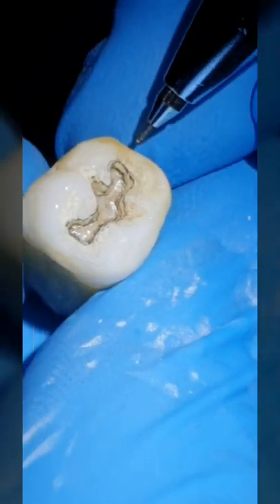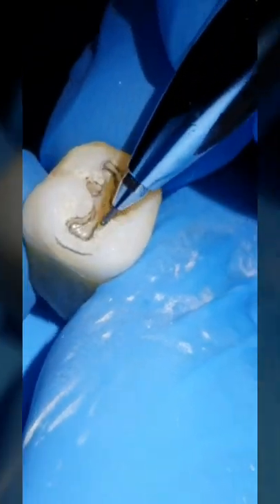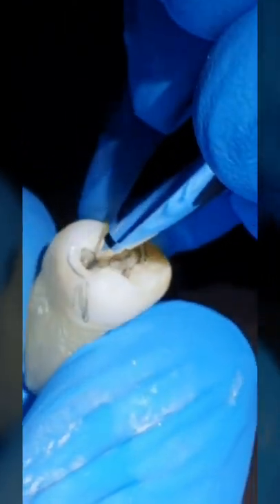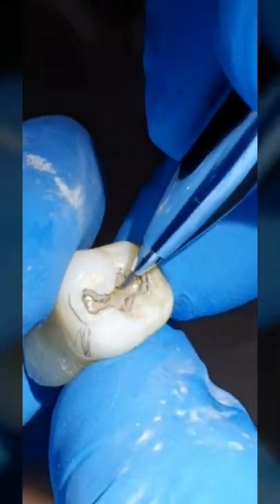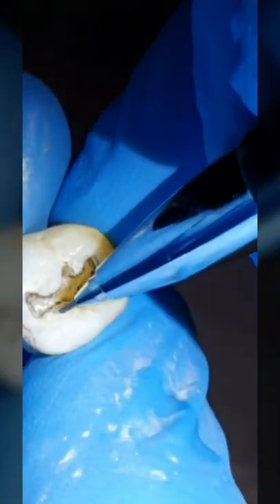The dovetail wall on the side has to be parallel to the marginal ridge. This wall has to be parallel to the marginal ridge, but this wall is divergent compared to that wall. This wall angulation has to do with the interproximal angulation of the tooth. So that wall from inside out would be the same angle as the emergence profile of the tooth. And here you have it. Everything is divergent from inside out. You should be able to see the internal lines as well as the external lines simultaneously, and that is the only time you'll be able to do a wax pattern or an indirect restoration and be able to cement it.